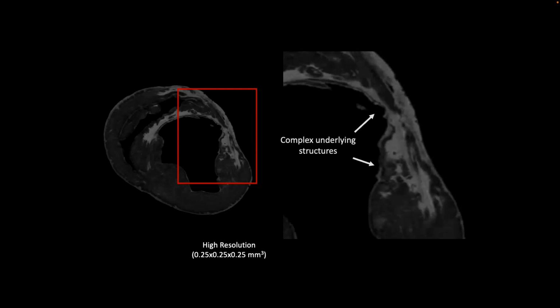And this image would say, well, the penumbra is not actually some different type of tissue. It is a mixture of normal, viable tissue, maybe not normal, but viable tissue that is not infarcted, with interdigitated infarcted tissue at really high detail and high frequency, right? So when I look at this and see these tiny little strands of infarct infusing this quote unquote normal tissue, and here I have a strand of non-infarcted tissue, here I've got strands of non-infarcted tissue, and they're all mixed together. This actually looks pretty dangerous.